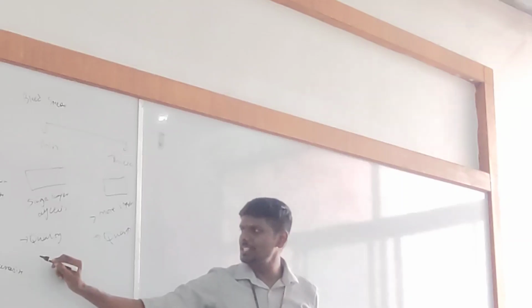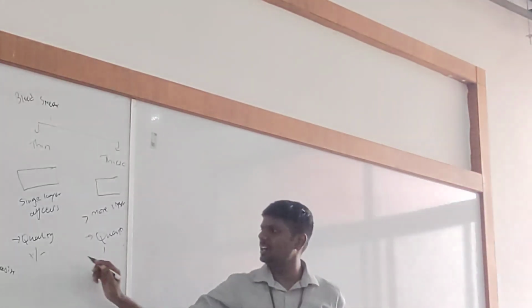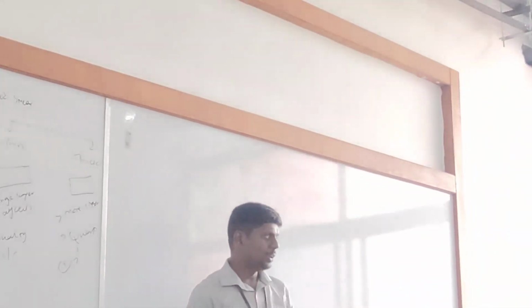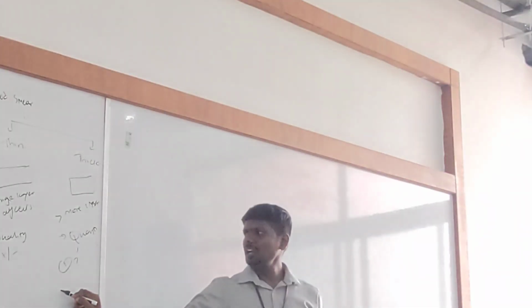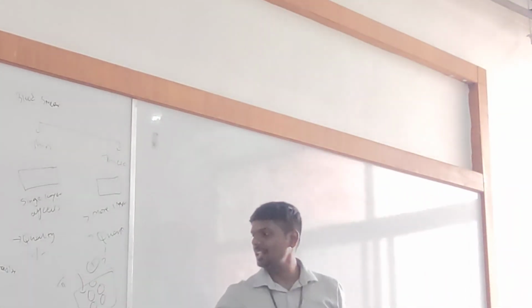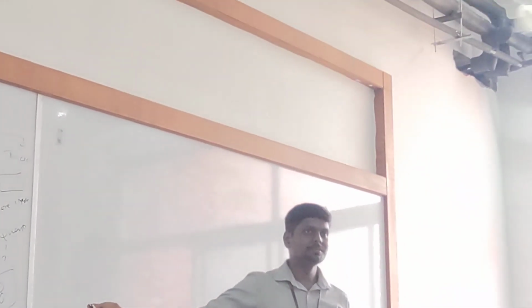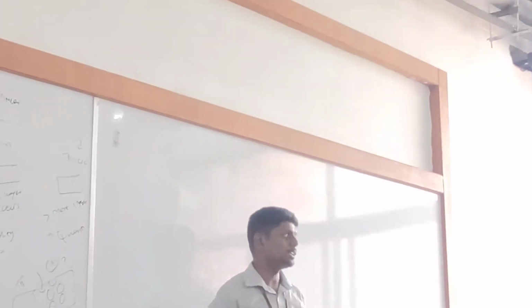Simply, the definition of qualitative is either presence or absence of something. Quantitative means to quantify the count. If something is present, how much of it is present. That is called quantitative. Now listen, Abhishek came with one logical approach, but that is wrong in this case. If you are trying to count something and the counting is in double layers, imagine this is the depth, top portion and bottom portion. Now you have a double layer. You will get false results. You are counting multiple cells. It's not a monolayer. So we can't count cells in a multi-layered smear. That is a thick smear. That is not possible.